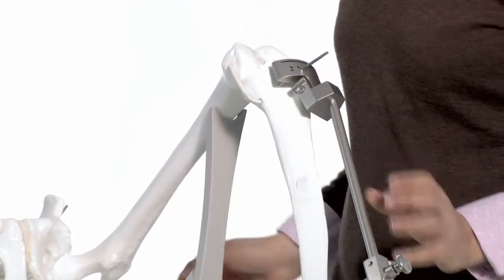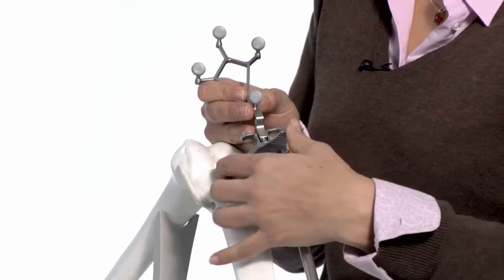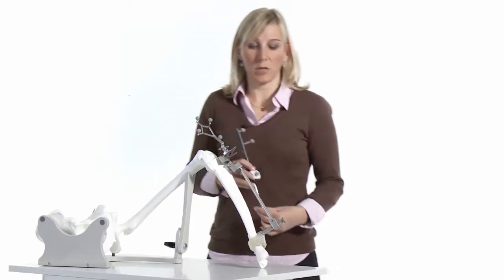After fixating the extramedullary rod, you just place the cutting block adapter into the cutting block slot as a bone reference. Then you can start with the registration.